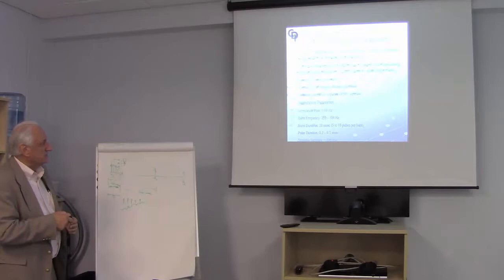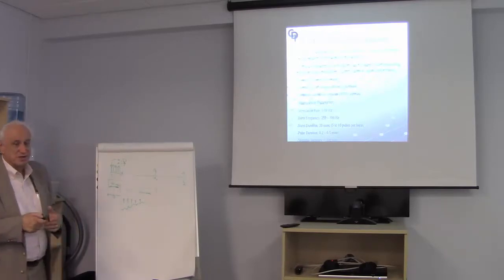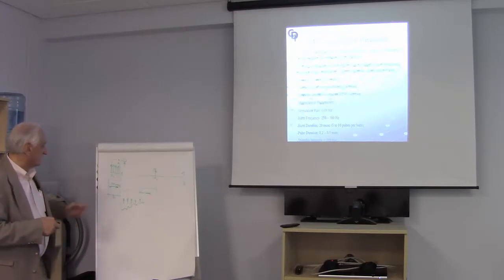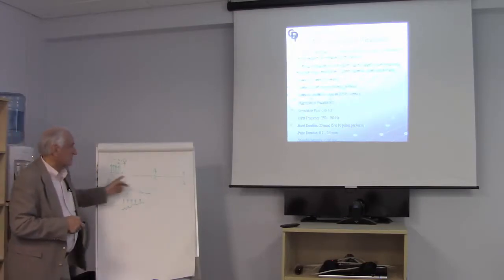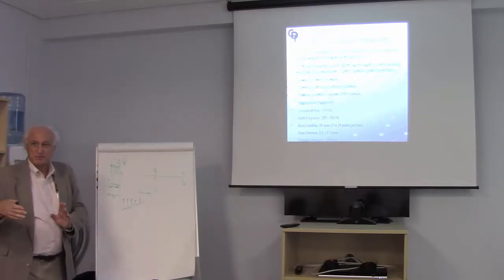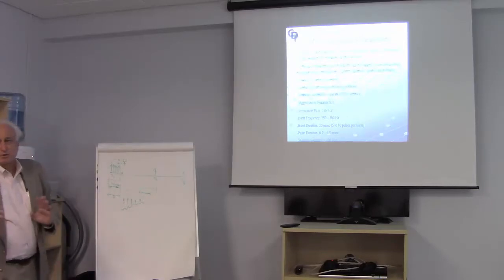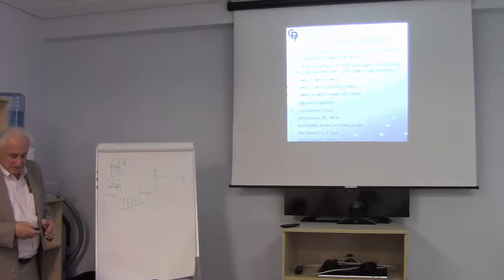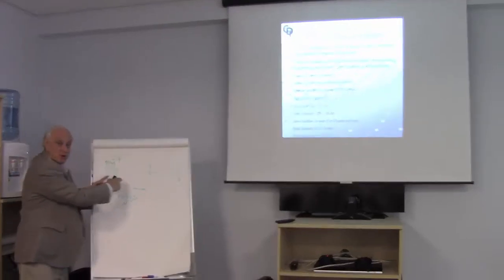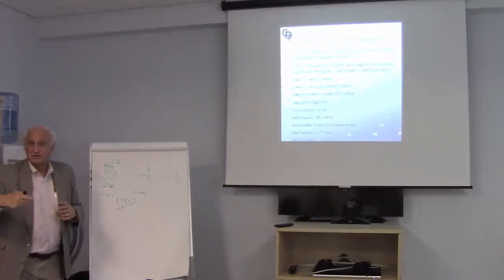So let's just jump down here. Stimulation parameters. This is always a big topic. I get phone calls from people all the time, wanting to review how we do this. So our stimulation rate, we talked about this from here to here. That's 0.89 hertz, or a little over 1 second, 1.1 seconds. Some people will use a longer time between bursts of pulses. It's almost what your personal experience drives. The thing you don't want to do is make this time too small. You want to keep it around a second or longer.